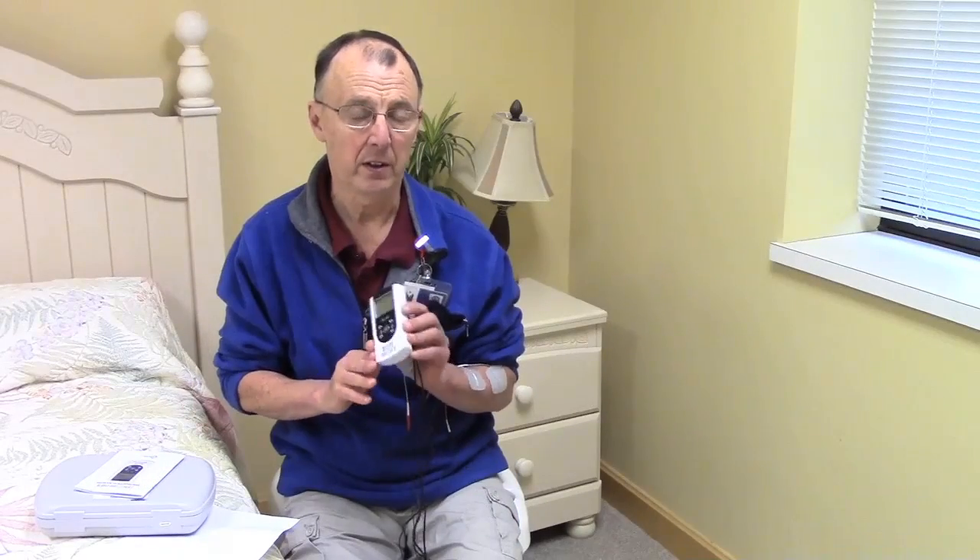Hi, I'm Peter Bedreau. I'm an occupational therapist at the Rehabilitation Institute of Oregon here in Portland. Today I'm going to be showing how to use an electrical stim device on a stroke patient to help their arm recovery.